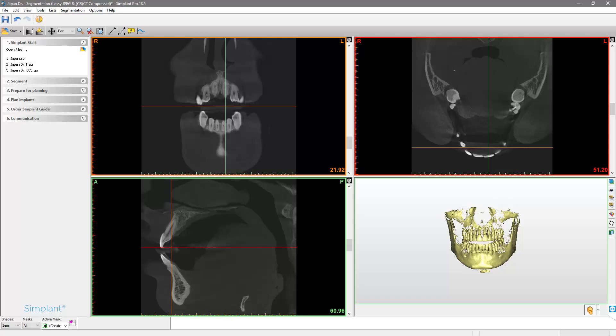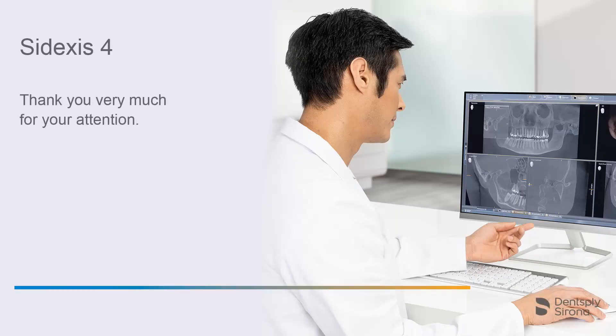After going through this procedure once, the Simplant Pro software will open the X-ray data sent by Sidexis 4 for all upcoming cases automatically. Thank you very much for your attention.